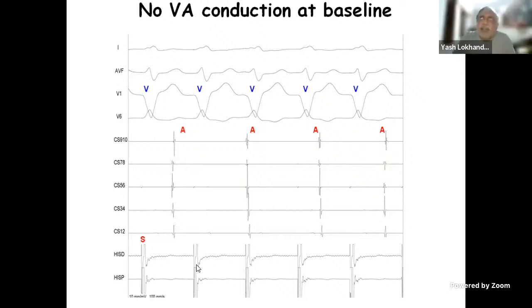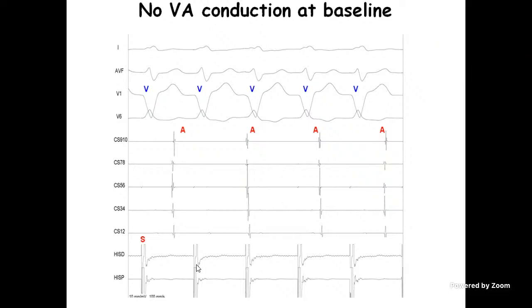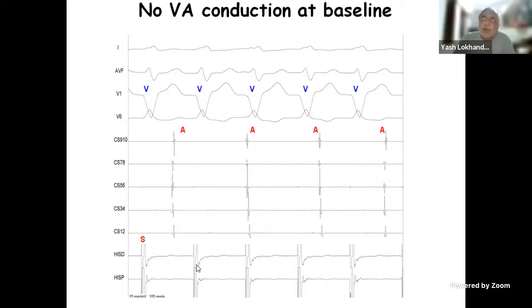Now let's forget intracardiac tracing, and think of a basic concept. Which are more common: the manifest accessory pathways, that means WPW, or the concealed accessory pathways, that means a normal ECG but still a hidden accessory pathway? Which is more common, the WPW or the concealed pathways? Concealed ones are more common. Okay, so concealed are more common, and why is that?